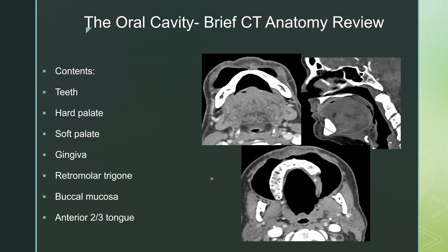A brief review of the CT anatomy of the oral cavity. The contents are the teeth, the hard palate, the soft palate, the uvula, the gingiva — which is along the surface of the bone — the retromolar trigone, which is that space between the mandible and the maxilla pointing posteriorly, the buccal mucosa, and the anterior two-thirds of the tongue.